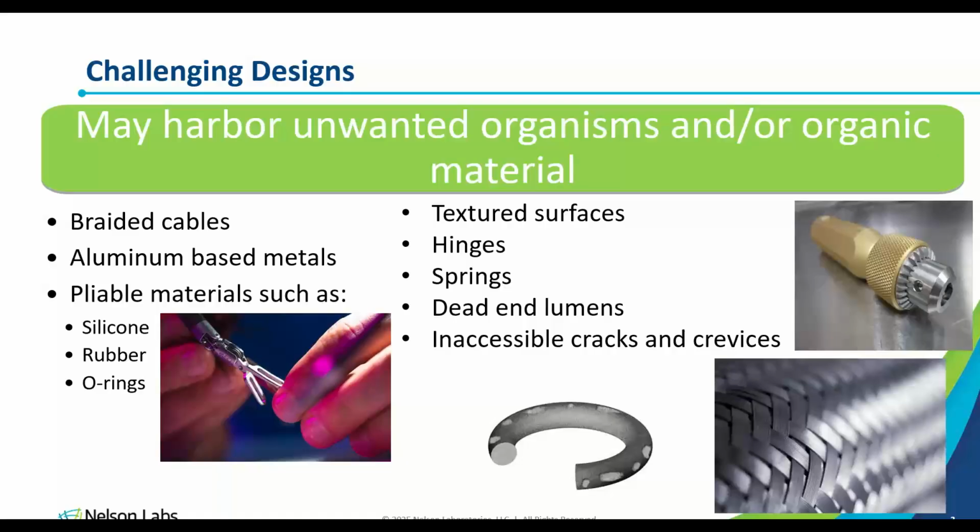In practice, you do need to have instructions in your IFU that will dictate the end user to dry the device efficiently and sufficiently so that it's not wet when it goes into the autoclave or the steam sterilizer or whatever the terminal process is, because that's going to impact that terminal process and it's going to impact your device.